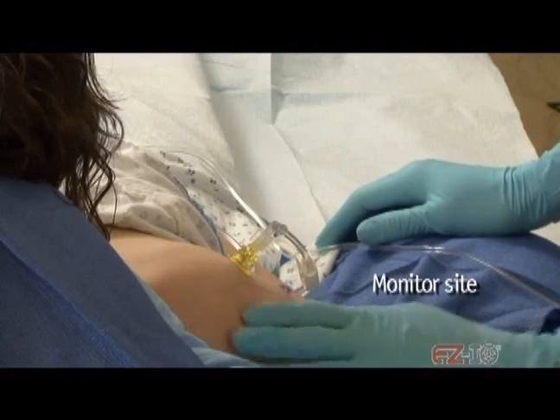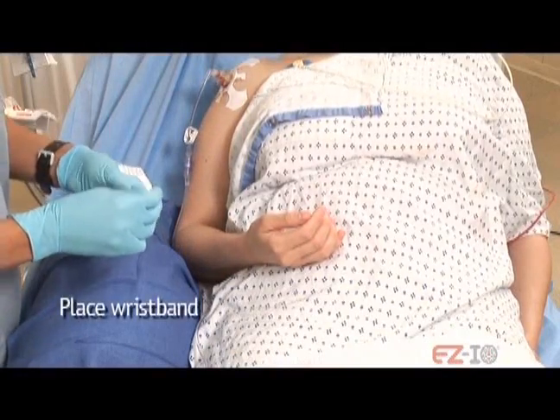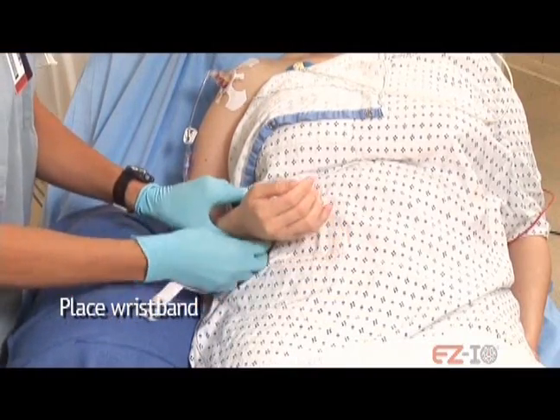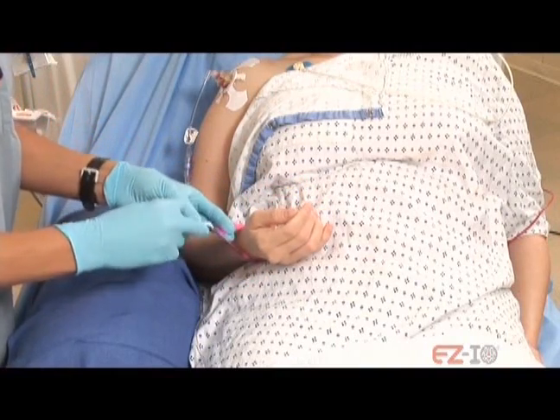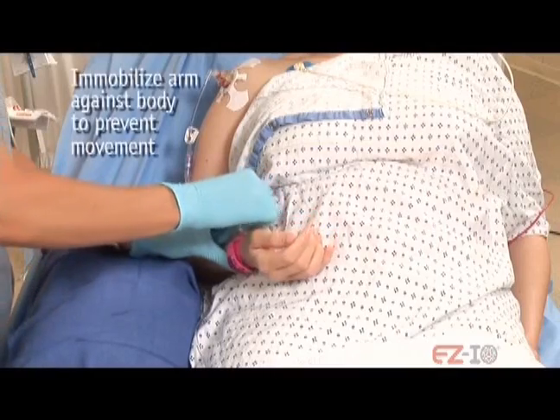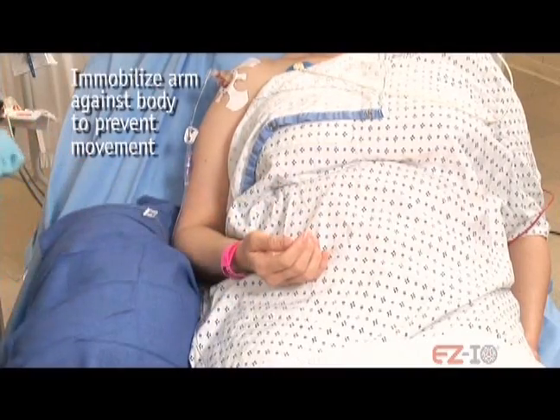Good there. All right. Okay, so now that we've got that in, I just need to put a wristband on you. This identifies to everyone else in the hospital that you have an IO in place. Place the wristband on the patient, indicating the date and time of Easy IO placement. All right, that's it, and we're done.